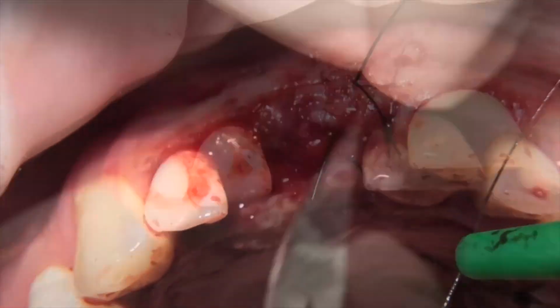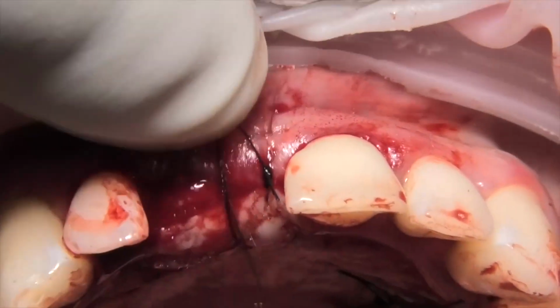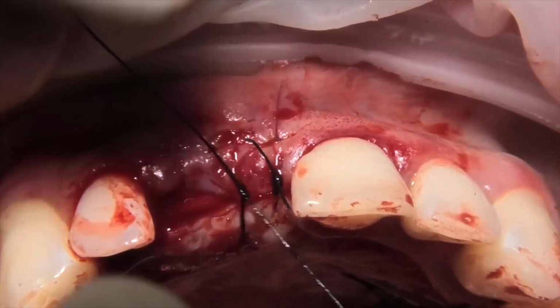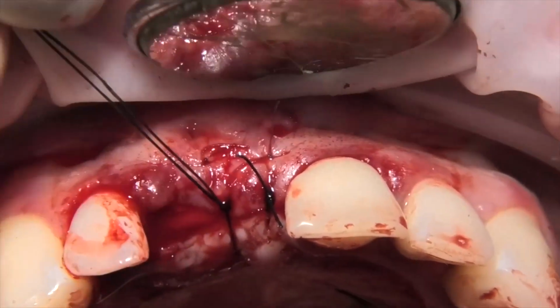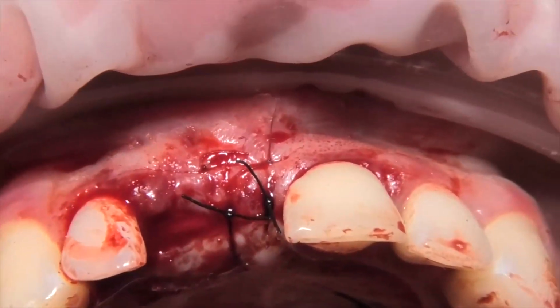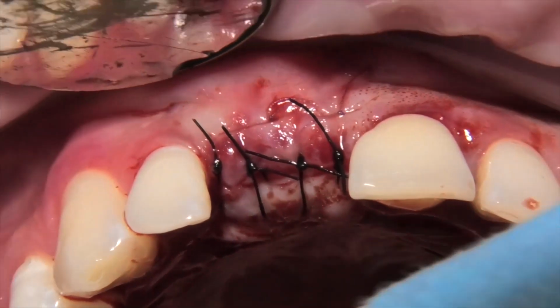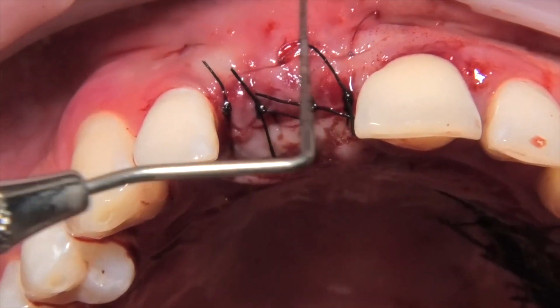So we can place the single sutures from the mesial aspect to the distal aspect to close the space and the flap. This is the end of the surgery video.